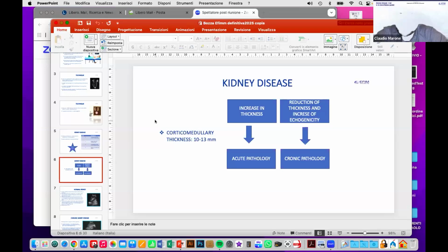So in the beginning of this case, the kidney is enlarged. So even if it's a chronic disease, in the beginning, that's an enlarged kidney in the first phase. But I saw just one. So maybe if someone of you has more experience about it, can help.